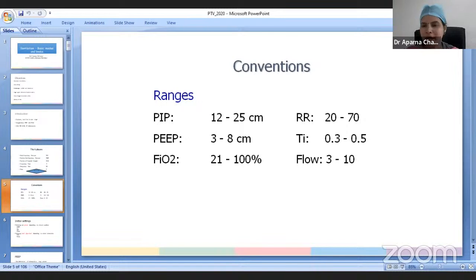When it comes to the other four parameters, PEEP is assessed clinically based on the presence of retractions, recessions. So with adequate PEEP, the baby should have no or minimal recessions, and adequate chest expansion, which is measured by the presence of 6 to 8 posterior intercostal spaces on the chest X-ray, and the presence of adequate oxygenation with least FiO2.